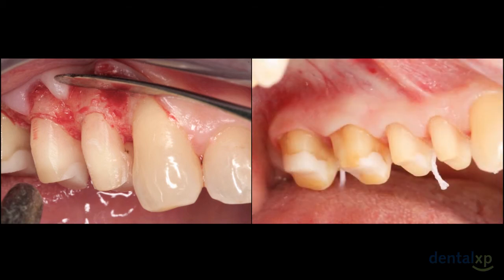This is the day of impressions, and I will spend a minute with you to explain the way my restorative dentists take their impressions. You are looking at a number 7 Siltrex cord. It is placed only in the sulcus and for only one reason. This will allow the lab technician to have room to trim the die without touching the margins. It is not placed for any other reason.